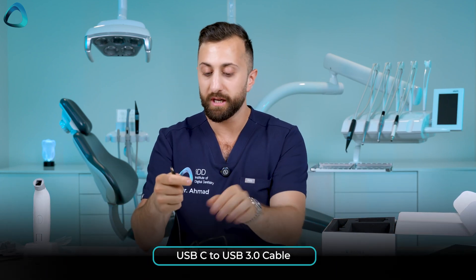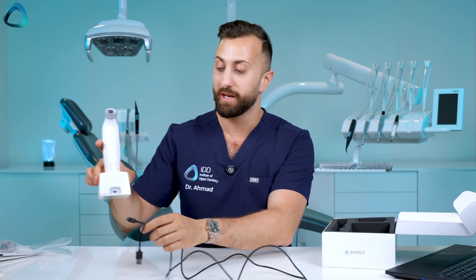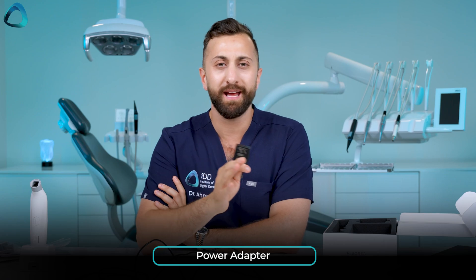We also have a USB-C cable which plugs into your computer and into the wireless charging station to charge the Borea Cobra, plus a power adapter if you prefer to plug into the wall. Finally, there's a small wi-fi dongle that needs to be connected to the computer you want to use with the Cobra — don't lose this, though it can be ordered as an additional accessory. That's everything: the Cobra unit, charging station, cable, wi-fi dongle, scanning tips, and a microfiber cloth.